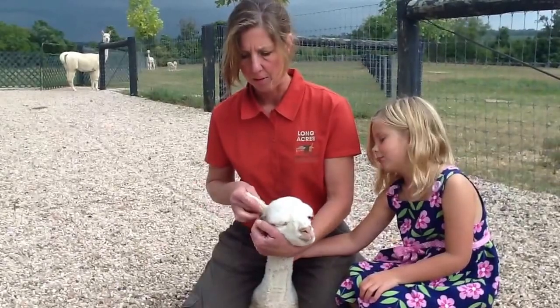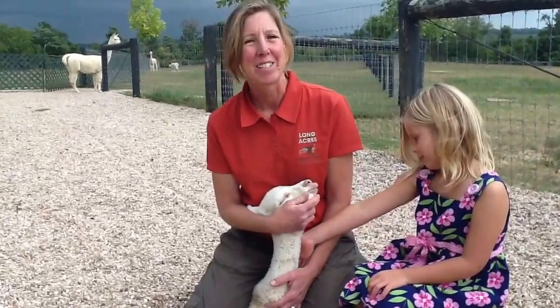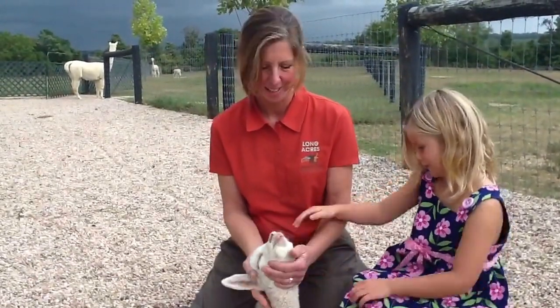I am very cautious about what kind of liquids I would put down. So that's the feeding tube for our crias. Hope you enjoyed it.